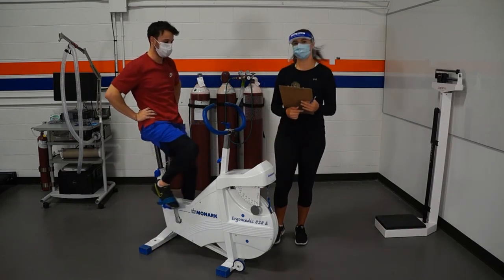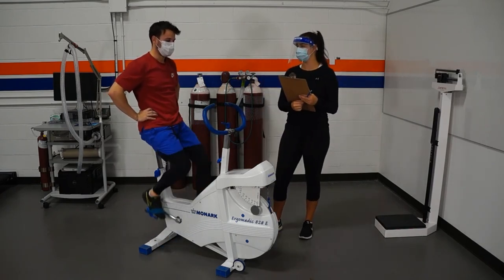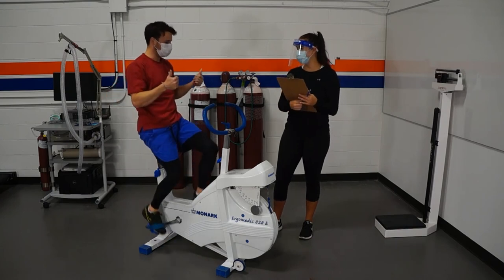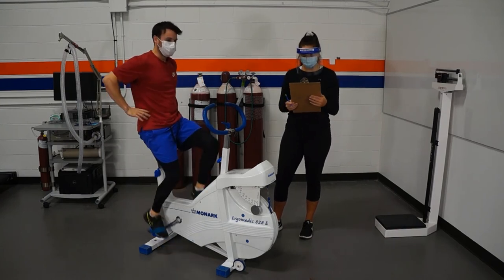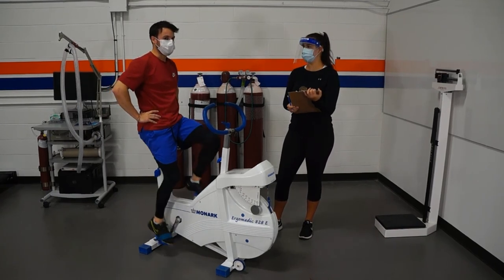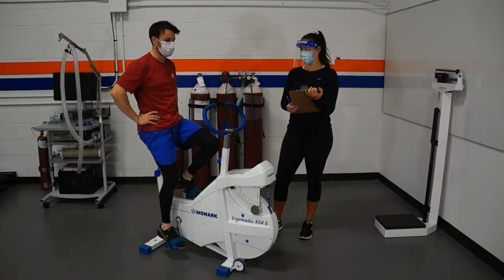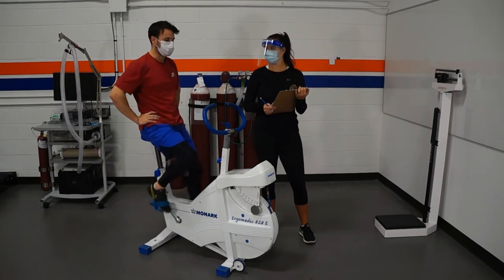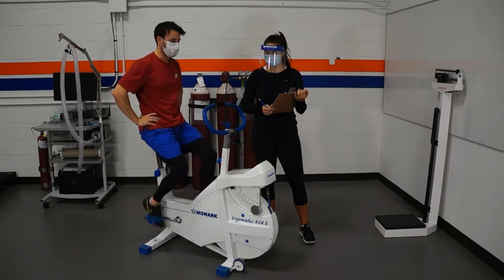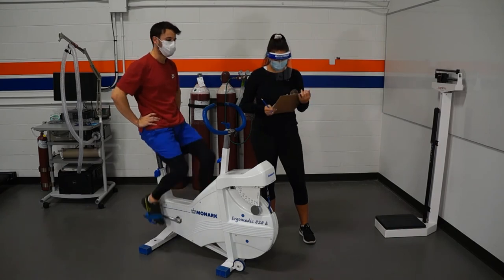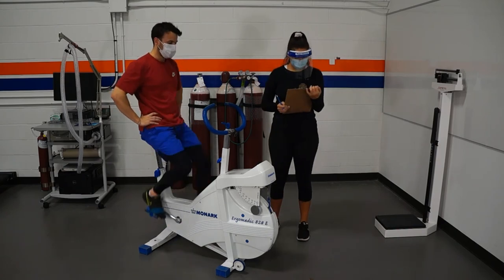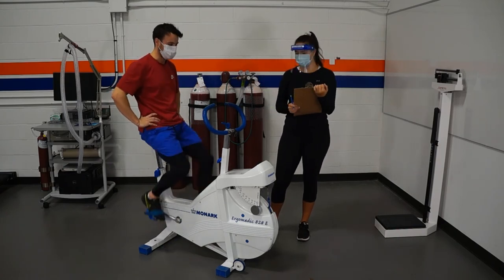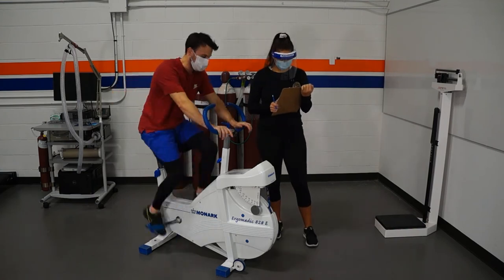At that point, you then loosen off the resistance back down to 0.5 kp so they are not completely spinning freely but they do have some resistance to work out the lactic acid in their legs that they have built up, allowing them for a full 3-5 minute cooldown before a passive cooldown again of another 3-5 minutes before their heart rate falls back below 100 beats per minute.